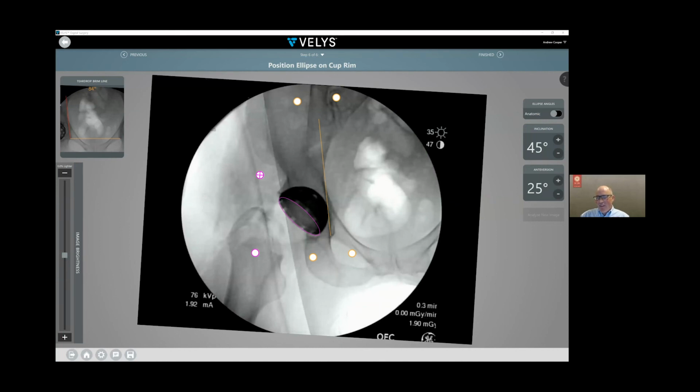But at the end of the day, I'm hopeful that I can impress upon you, when you trial something like this, once it's your workflow, the goal, of course, is to not slow you down. It's actually to make fluoroscopy be used to your benefit, to reduce the headache. I use 6 to 8 seconds of fluoro now. I do cases in 25 to 30 minutes. I promise you, I'm not a technically gifted surgeon by any means. I have an ability now to have a great workflow with the technologies that I use, that I don't waste time with X-ray anymore. I use it to my advantage, and I greatly feel that technology can make that a reality.